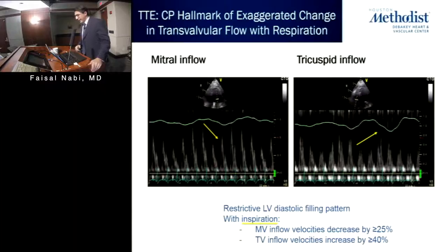And this really, I hope you'll appreciate, is the hallmark of constrictive physiology, where you have a dissociation of intrathoracic and intracardiac pressures, and therefore this ventricular coupling that occurs with respiration. And with inspiration, I hope you can appreciate mitral inflow velocities decrease on a beat-to-beat basis, whereas they increase on tricuspid inflow velocities.